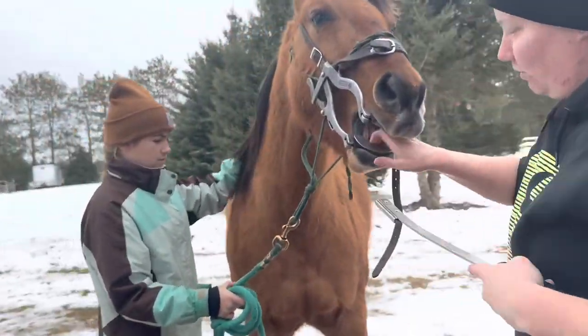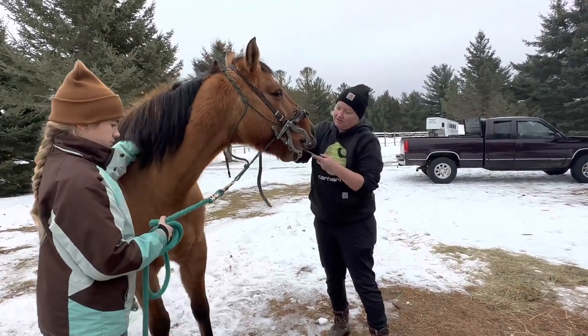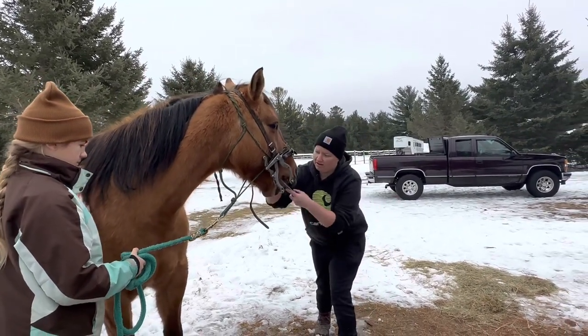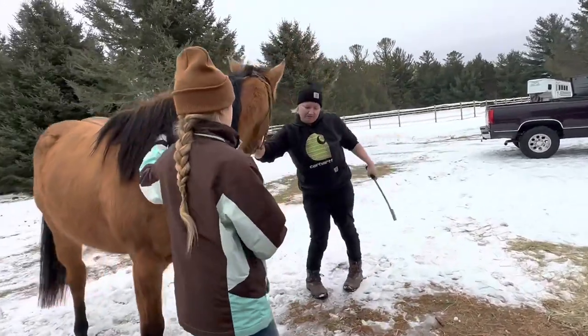Now, it's really important to make sure when we're taking the bottoms off that you're holding this tool at the correct angle. Their teeth on the bottom have an angle of about 11 degrees, and that's the most ideal angle for proper grinding against their tops. Okay, girl.